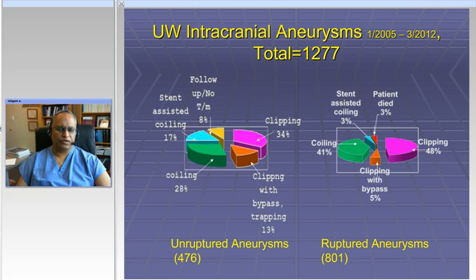Whereas with unruptured aneurysms, again, it is almost down the line, but a much larger percentage of unruptured aneurysms are being treated both with bypasses and or stent-assisted coiling techniques. And in future, there'll also be a large reflection of the flow diversion devices such as pipeline, which we've already deployed about 20 of, but we are treating a number of aneurysms this way as well.